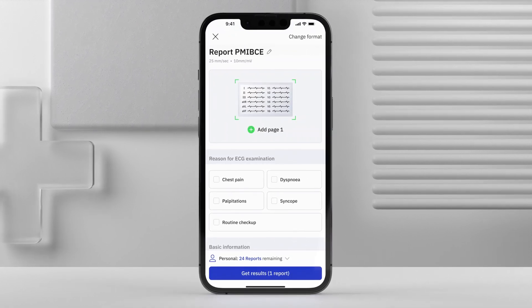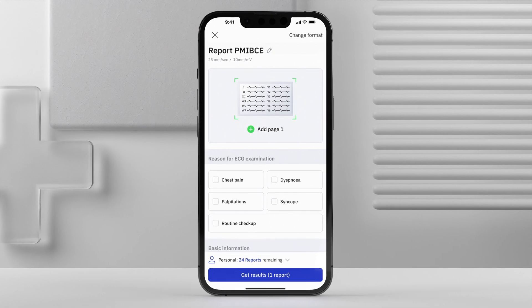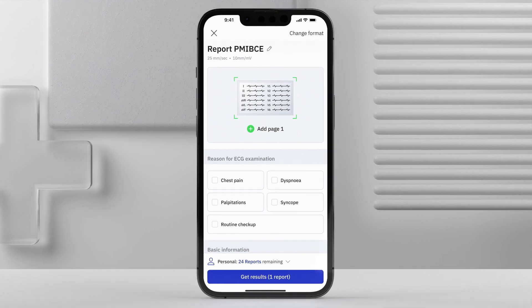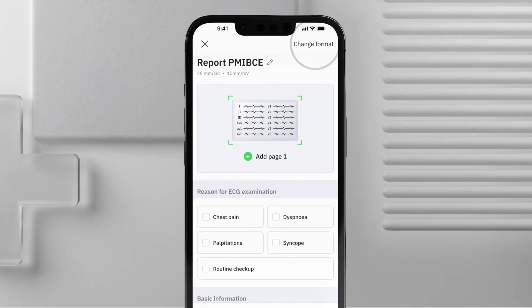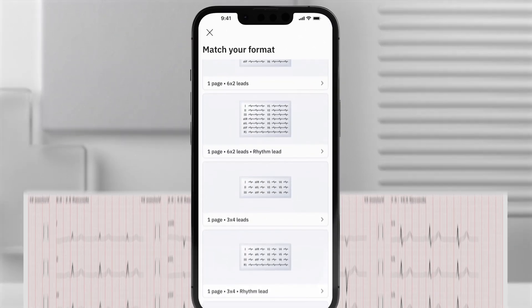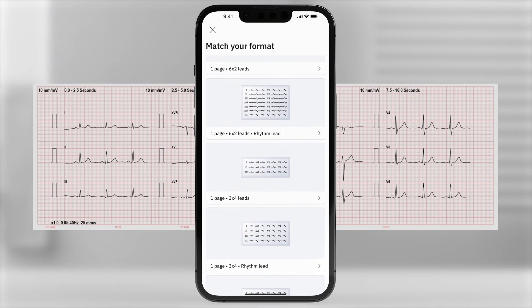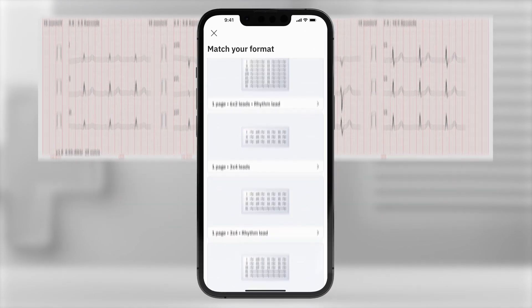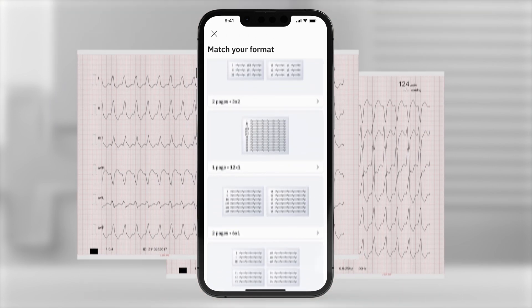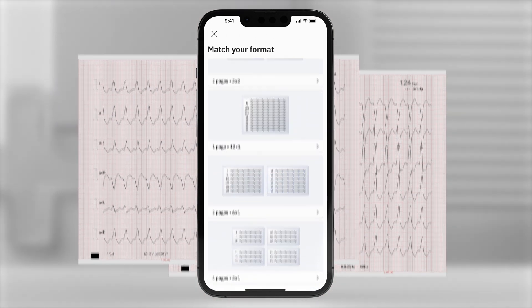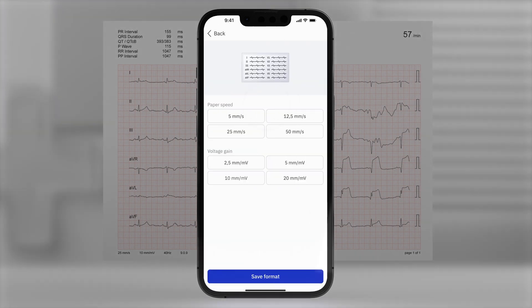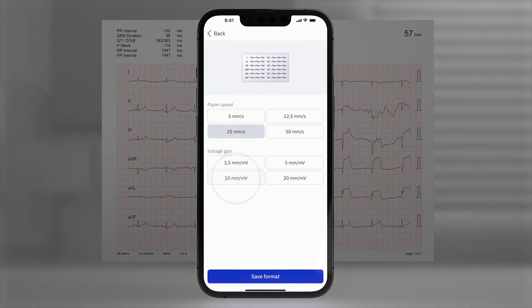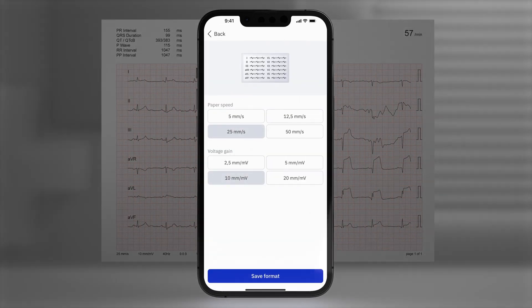Make sure that you have selected the correct ECG format. To change it, tap Change Format in the top right corner. PM Cardio is compatible with all standard 12-lead ECGs. Simply select the icon that matches the lead layout of your ECG. Choose the correct paper speed and voltage gain, then tap to confirm.